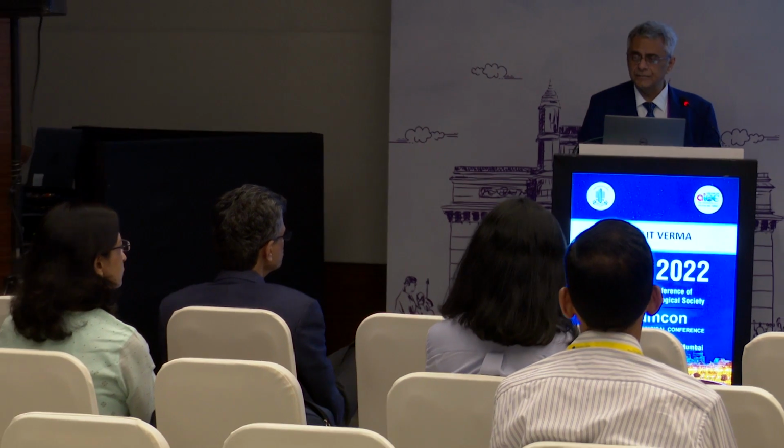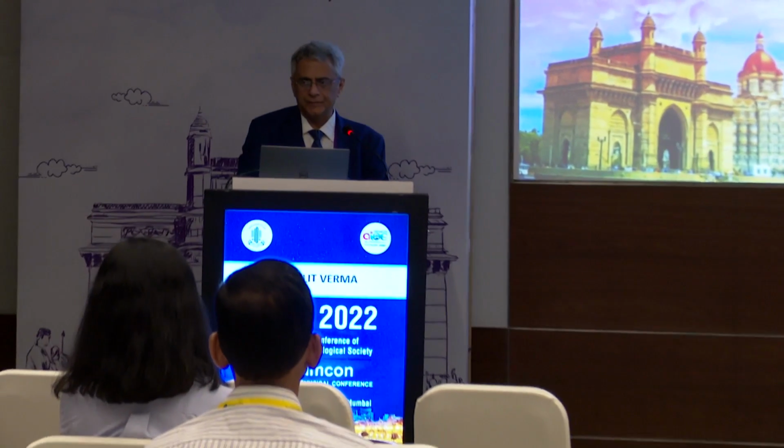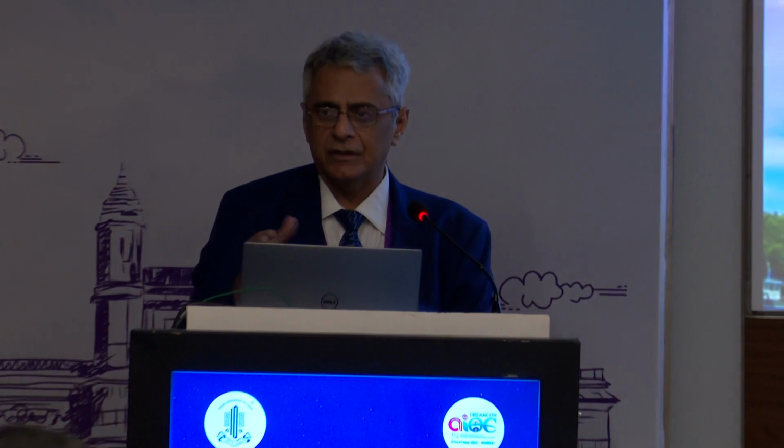Like a hot knife through butter. You can always suture the tunnel if you're using an old or not a good trocar, and when you're putting too much pressure on the globe and the wound is open, everything will prolapse out. The problem is if you are exerting too much traction, the whole globe will deform, and whatever is open, contents may come out, whether it is IOL, vitreous, whatever.